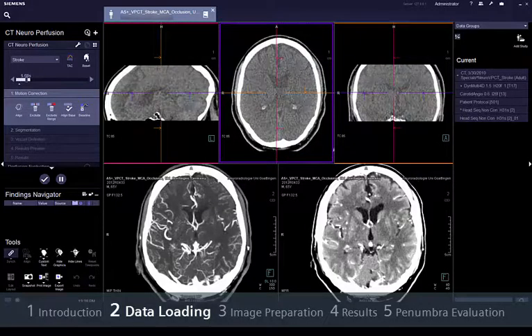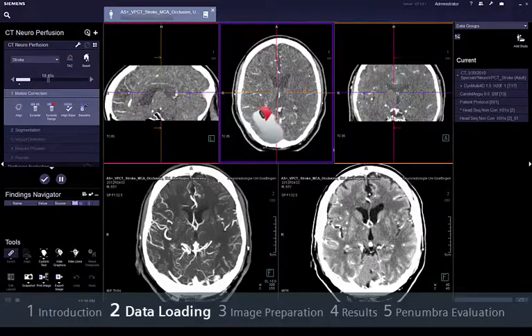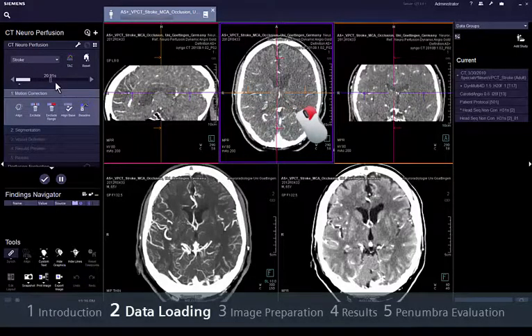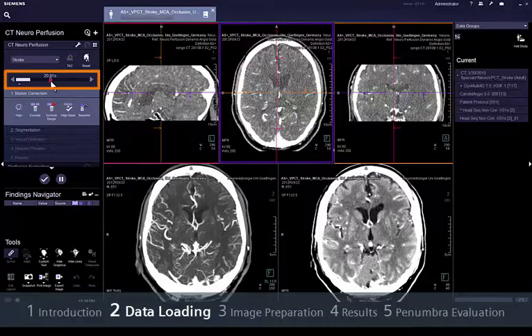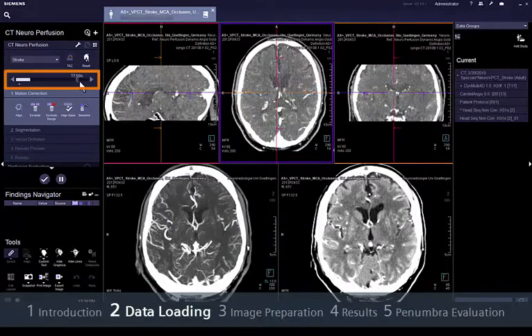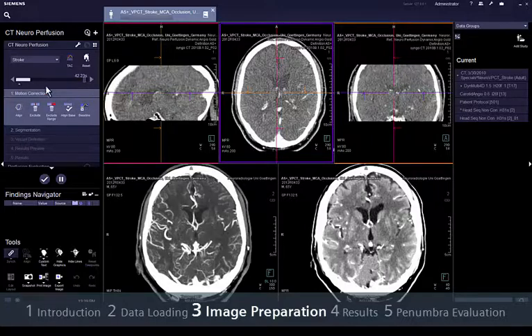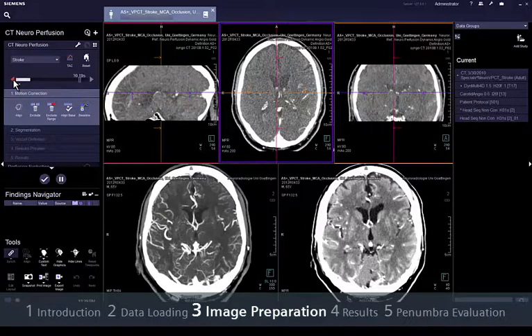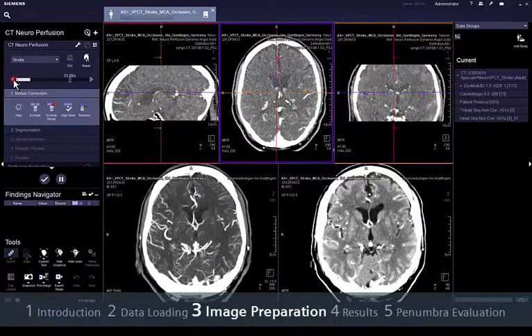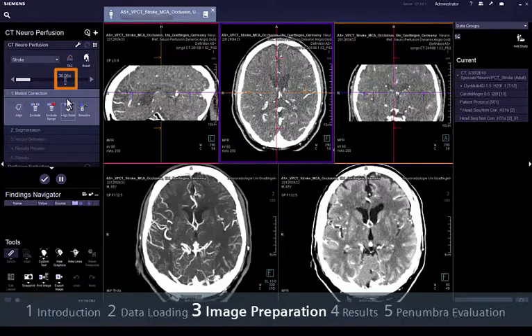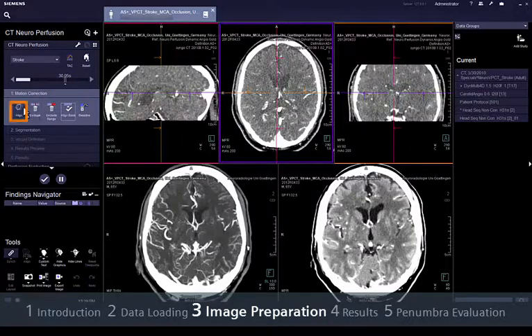To navigate through time, use the upper segments and drag the mouse horizontally while pressing the right mouse button, or simply by moving the time slider. The first step of our workflow allows motion correction. Just scroll through all time points to detect a good time point with minimal motion that could be set as a reference. Notice how the small triangle changes, and apply motion correction.